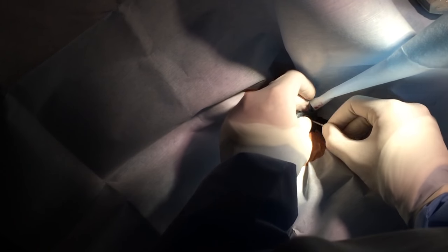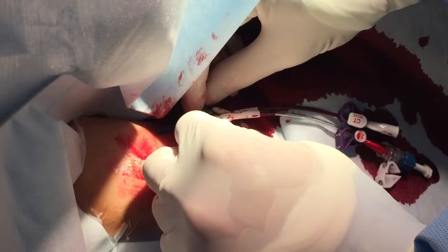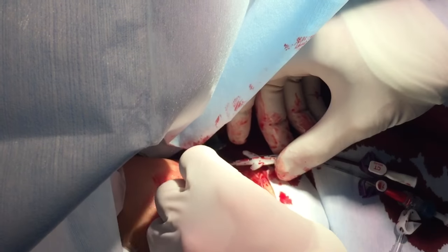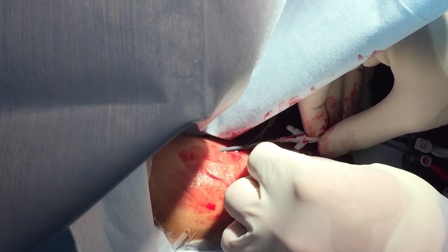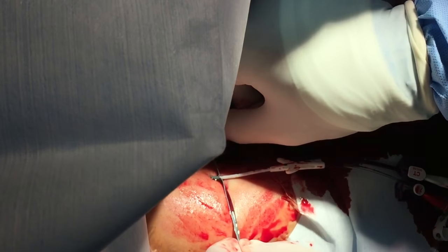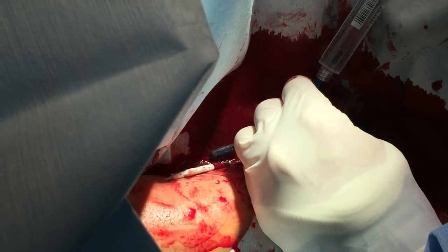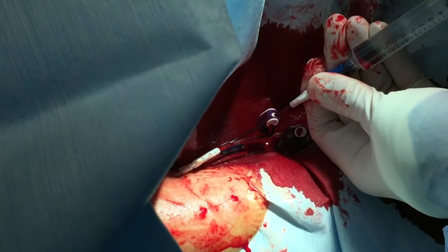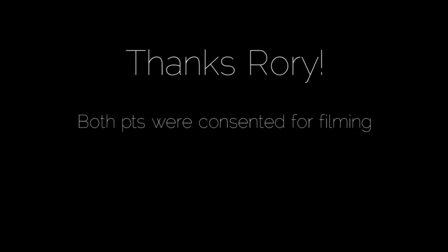Here comes the midline. It's already been stiffened and the wire's been made sure not to protrude from the tip. The midline's getting advanced — not all the way. We'll leave out a few centimeters so we can break our dilator. In, in, in — nice and smooth. Pull the dilator out; don't break it inside the skin, break it outside along the actual midline itself. Break, break, break — not to the skin. Pull back, break, break, break, pull back, and this will be the final pull — it's now fully split. We can advance the midline to the hub. We're going to check both ports — there's some nice blood. It had already been pre-flushed; we're just checking the patency of each lumen. And there you go.